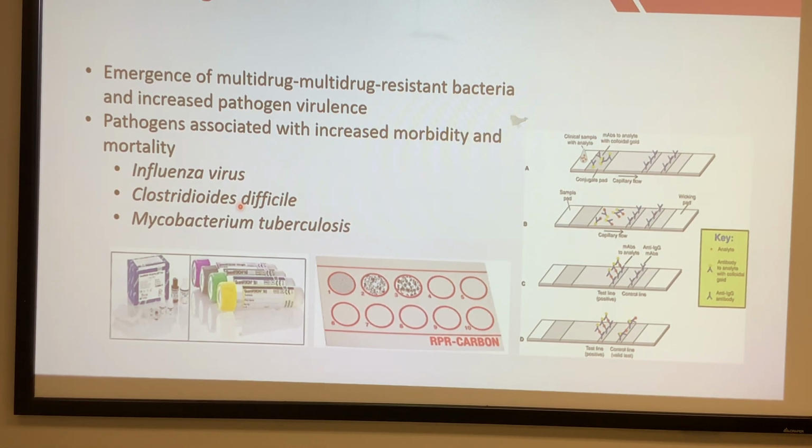COVID, rapid test? Yes, COVID has tons of these, okay? The FDA has cleared hundreds of rapid tests for COVID, and they are all antigen or antibody-based immunological tests. And this is how easy they are, okay? But anyway, the reason for us to have rapid tests is because we want the test result to have a really good turnaround time.